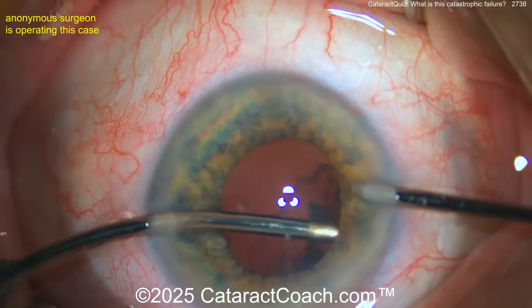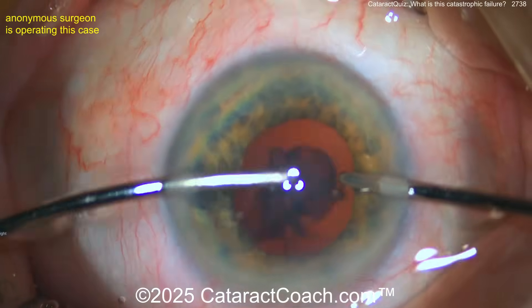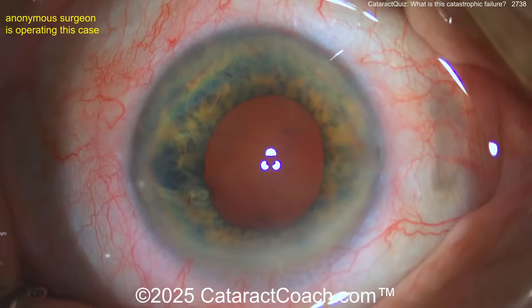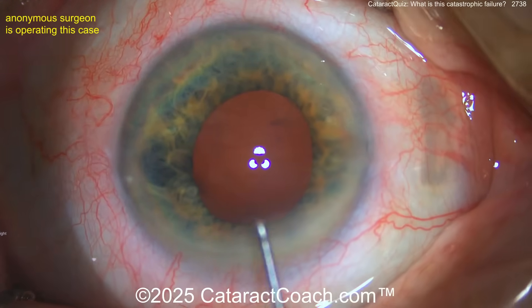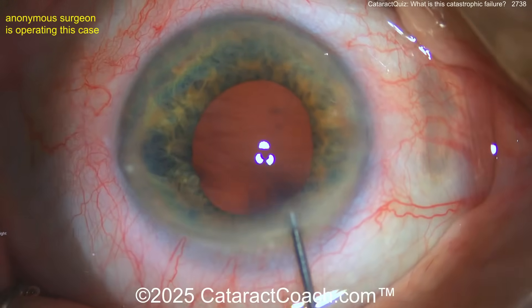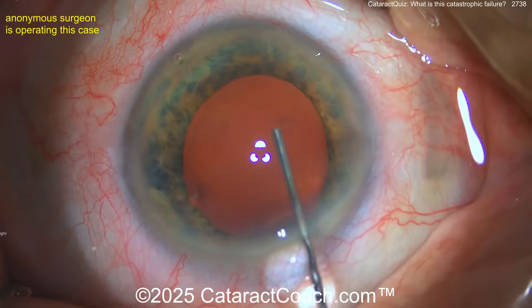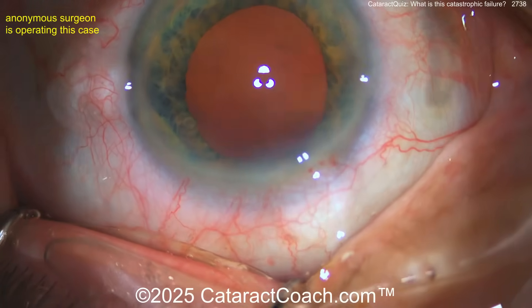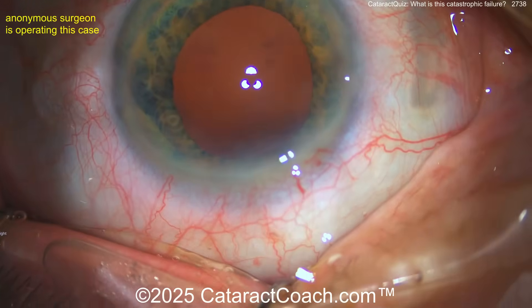Now bimanual cortex removal — look at that, looks pretty good. Bag's intact, posterior capsule's intact. It looks pretty good. Now watch carefully: look at the main incision. What do you see? A little Descemet's tag — that's a little Descemet's tag at the main incision.